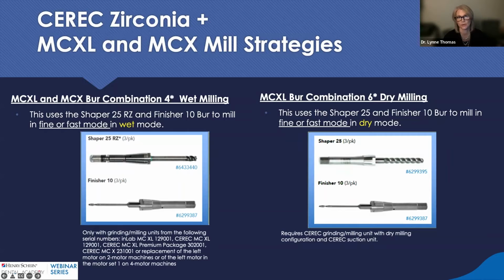Prior to milling the zirconia, you have to flush that milling chamber because of the remnants from other ceramic that you may be milling. So if you're using Emax or Tessera, those remnants can actually cause defects in your zirconia product if, while milling with the water, it gets absorbed into your zirconia crown. So it's very important that you clean out the chamber and do a little flush. There's a process for actually doing that. And then you put in an absolutely clean water reservoir for your milling, okay?